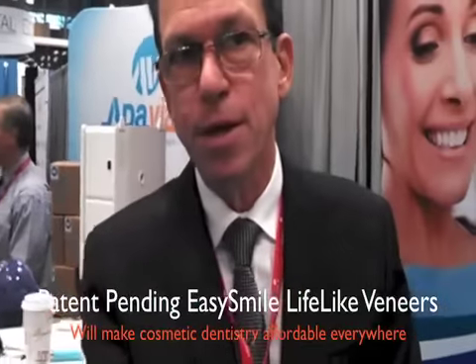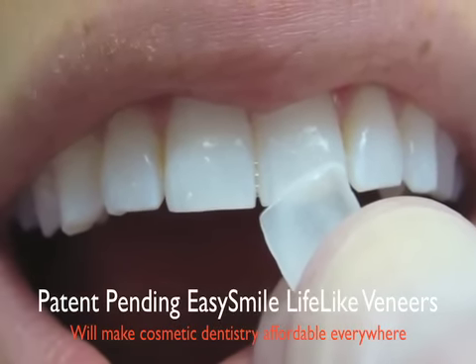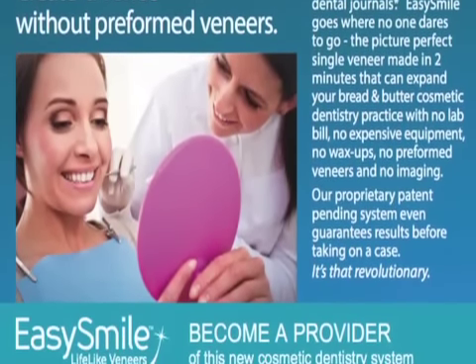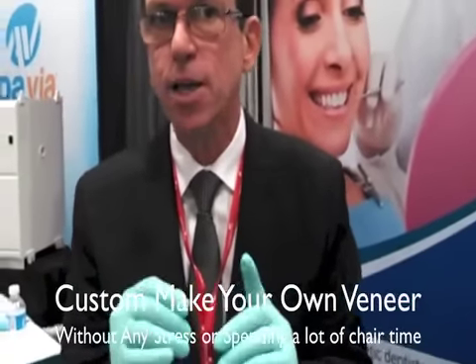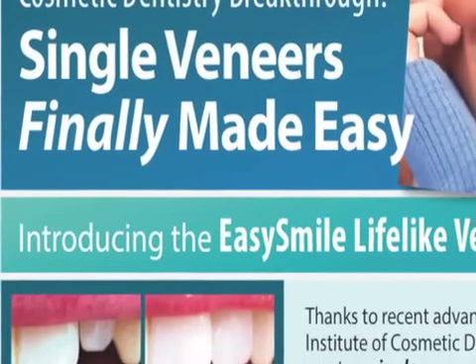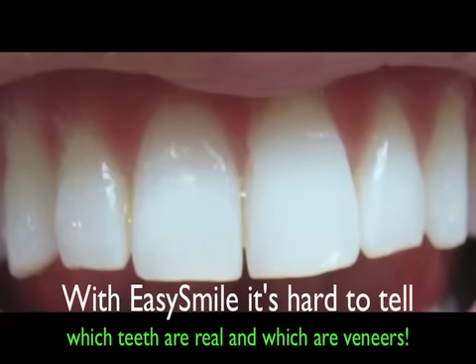You're able to have great translucency, which is what makes it look so natural. It has opacers built in, and at the same time it's naturally translucent. That's how you get beautiful aesthetics and a very natural-looking veneer. The best cosmetic dentistry is done by doing the least amount — one tooth, or maybe two teeth, solves your patient's problems.